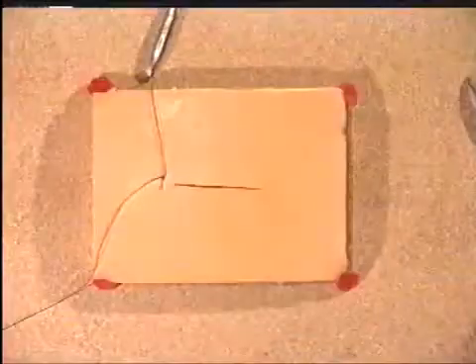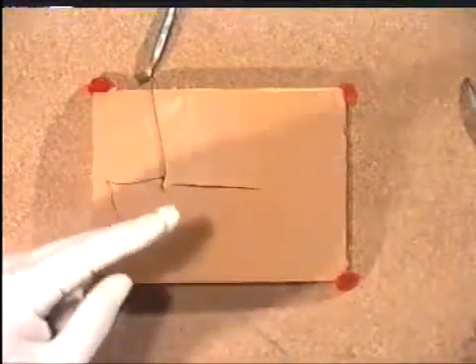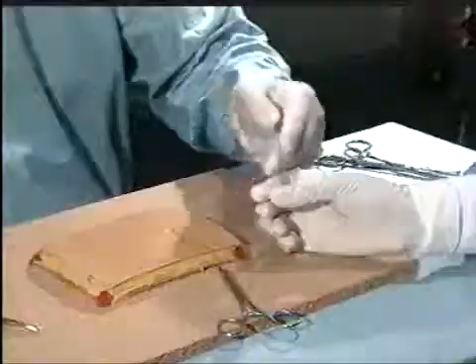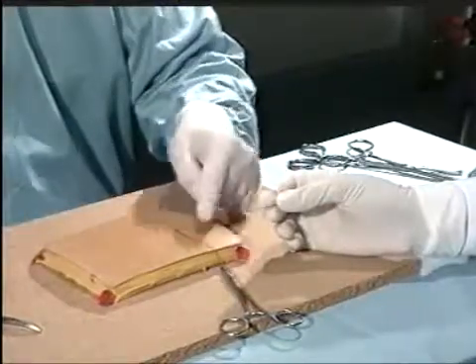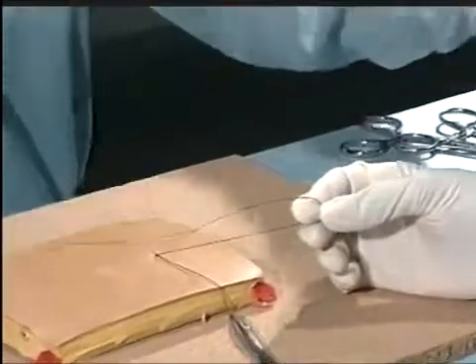Grasp it in the tip of the jaws and place to one side. Then pass the other length of the suture to your assistant and make sure that they hold it the right distance from the wound. Not too close and not too far away.